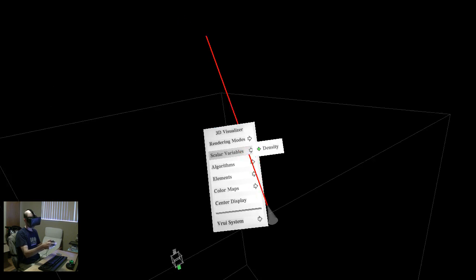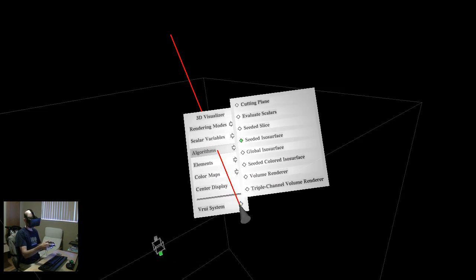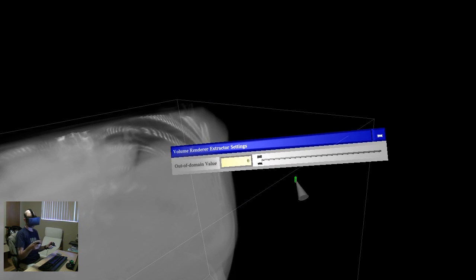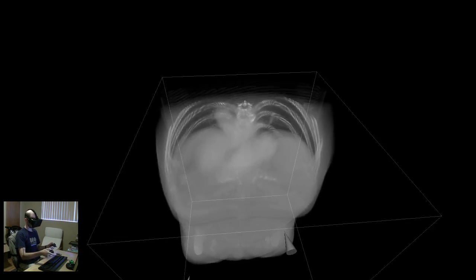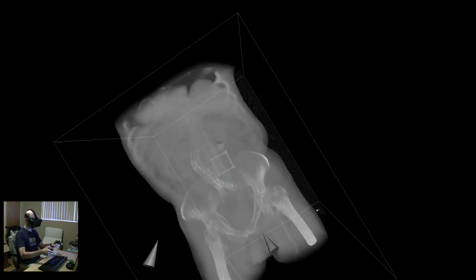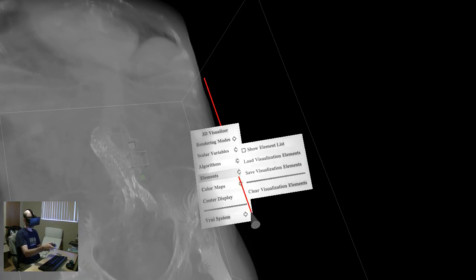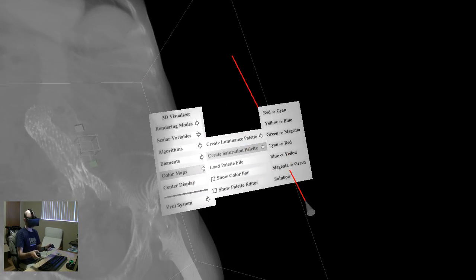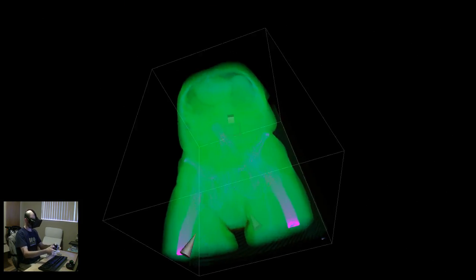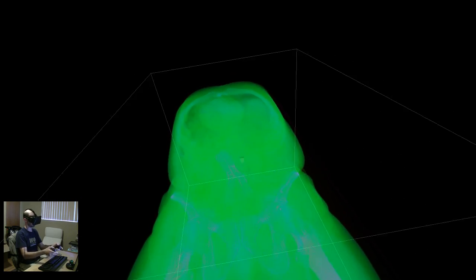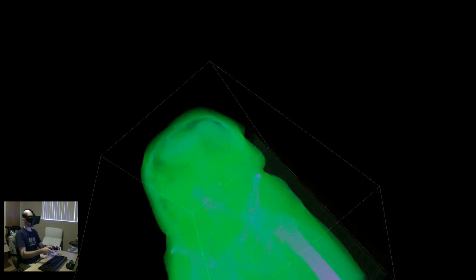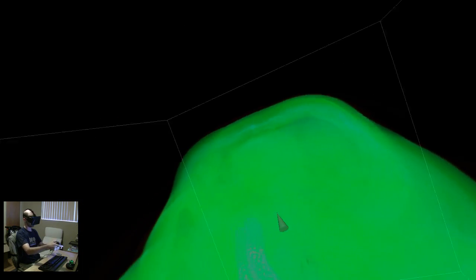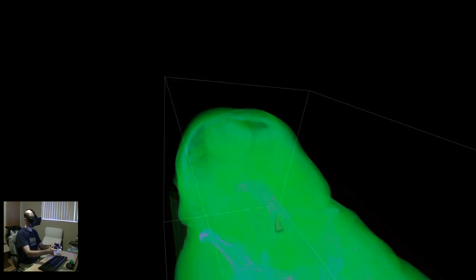And then I'm going to make a volume renderer. Let's see. Assign it to a tool, press the button, delete it right away. And here we now have a volume rendering of this patient. Volume rendering is sort of like volumetric fog. I'm going to change the color here, make it a little bit less boring. It's not as boring, but not necessarily pretty. It doesn't matter. It shows the actual density values associated with each point in the model as a transparent fog. So you can see the soft tissue here and the entire body of this patient. You can still see at a different color, the stent right there in the middle.